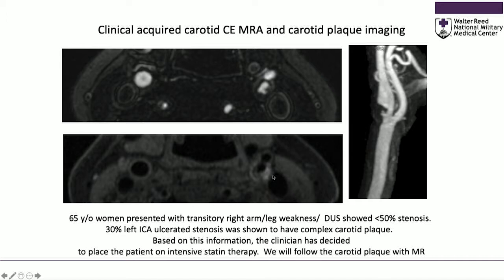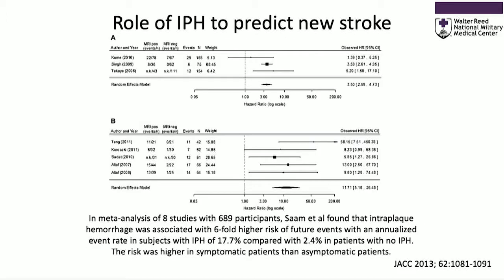This was a 65-year-old female that presented to an MSU neurologist, Michigan State neurologist, when I was there. He was very confused, wasn't sure if this was a seizure or TIA. The brain MRI didn't show anything. By the time she showed up, she didn't have symptoms. We took an unknown and made it a known for him by simply adding that 4-minute sequence.